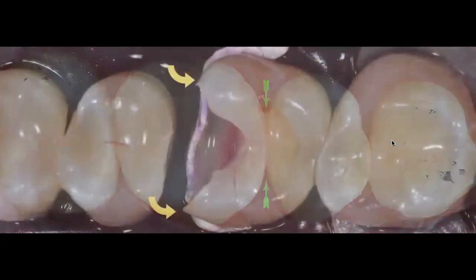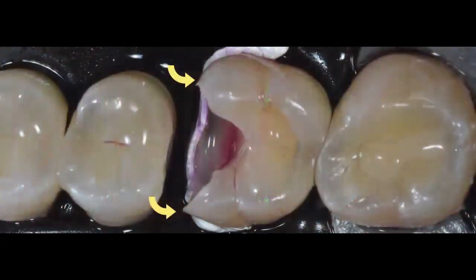Now, what happens when you have a case like this? In a case like this, not even the wide prep Garrison ring is going to be able to help you. The reason for that is that this second premolar, even though that proximal contact is a little bit flat, has most likely been affected when they prepped tooth number 3. I am able to recontour that, but I don't have any restoration for me to do on tooth number 4.